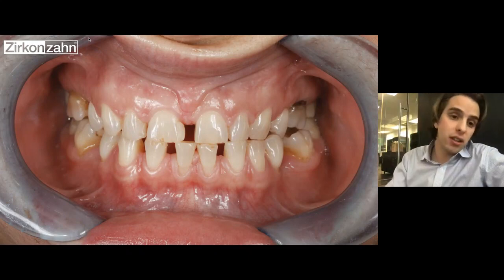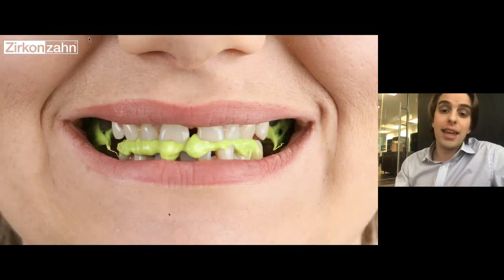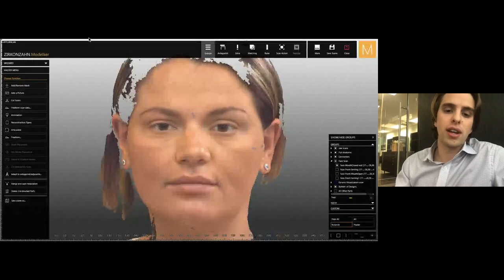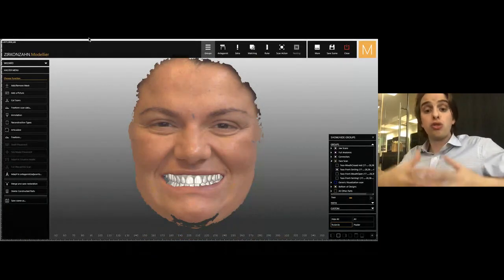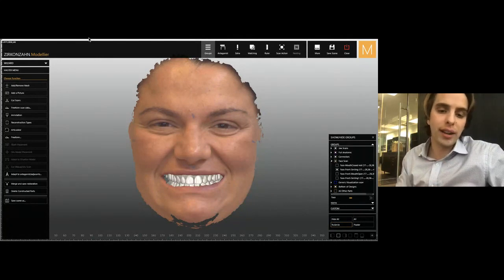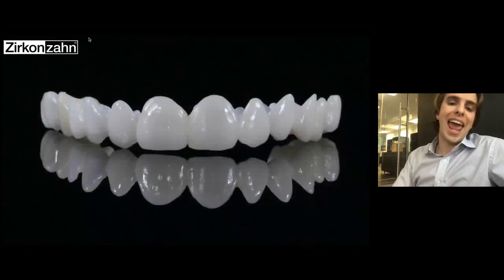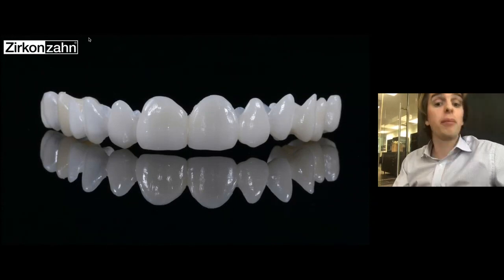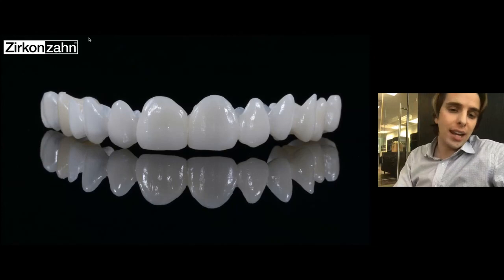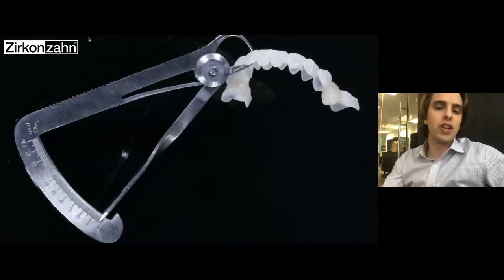We can already imagine that there might be some dysfunction with the TMJ, and we will simply capture the appropriate bite registration and then take all of the scan records as previously demonstrated. We bring our patient into the virtual waxing station and we do a full mouth tooth setup, upper and lower, which we can test on a virtual articulator. And in the first iteration, this will be milled as an anatomic bite splint in a material called multistratum flexible. It is a polycarbonate material with a seamless shade gradation running from the cervical to the incisal edge, and this will snap over the patient's dentition.